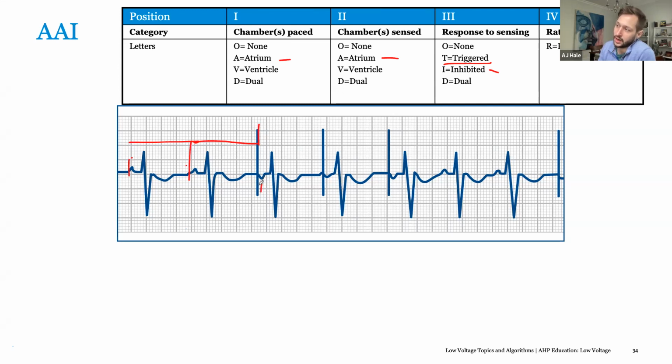You see depolarization here. And you can tell that we probably captured the atrium because you have this negative deflection on your P wave. Waits 1,000 milliseconds, paces again. Now, in this case, we probably have some degree of fusion. You can see this biphasicness to the P wave, which indicates that we probably contributed to it. So this would be an example of atrial fusion. You tend not to even see anything at all. It would either just not capture or we would capture, but 1,000 milliseconds, pace, capture, waits, something occurs, it resets the timer from there, 1,000 milliseconds, something occurs.